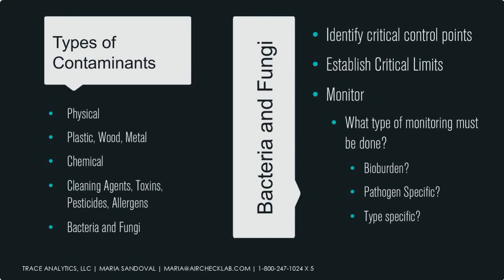And so when you're looking at bacteria and fungi as a type of contaminant, you need to be identifying critical control points. And you need to be mindful of if they're high risk or low risk. You need to establish critical limits. One thing that I'm hearing a lot of from our customers is, hey, can you please tell me how many is too many? And we'll touch on that in a little bit, but you guys need to be determining that based on your risk assessments and monitoring. What type of monitoring do I need to do?